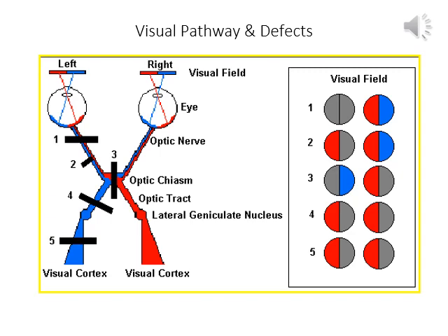Now the piece on the right that says visual field with a bunch of circles of different colors, what this represents are the visual fields that can be obtained. And so, for example, for number 1, the gray part means that the visual fields are not seen. And then if we see the blue and red, it means that those visual fields are seen.